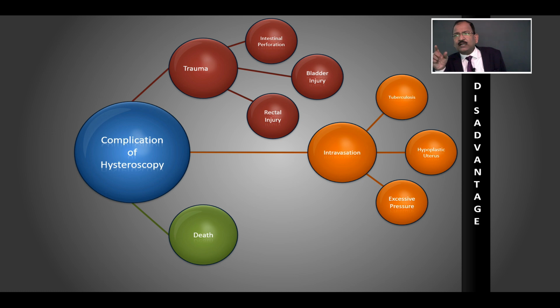What they do is they have a bottle and there is a needle with a pump, and they push air into the bottle. You have seen that? In the bottle there is a big needle and that needle is attached with one pump and they push the air into the bottle. Which bottle? Saline bottle or glycine bottle. And due to the air, pressure is generated inside the bottle. It is the cheapest device.